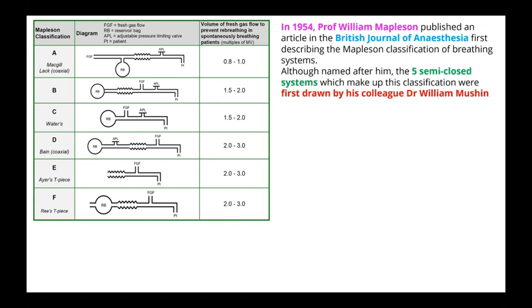When you wean a patient from the ventilator, what do you do? Or when you want to give supplemental oxygen to a patient who is left in the post-operative area with an endotracheal tube, the patient is not fully recovered, he has some mild inefficient breathing, but it is not necessary to put him on a ventilator.